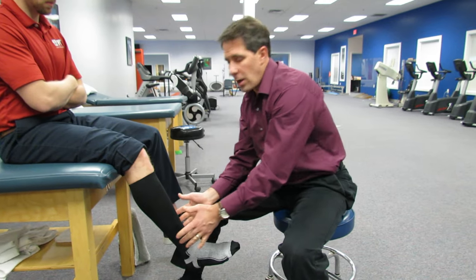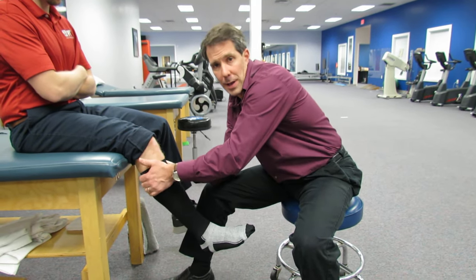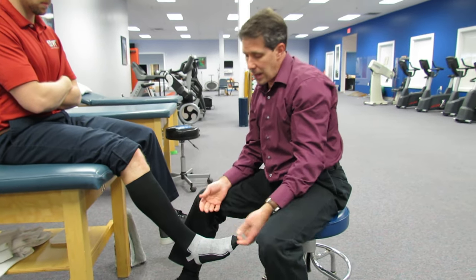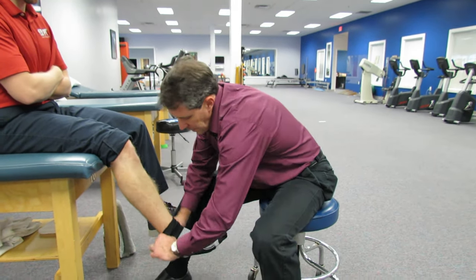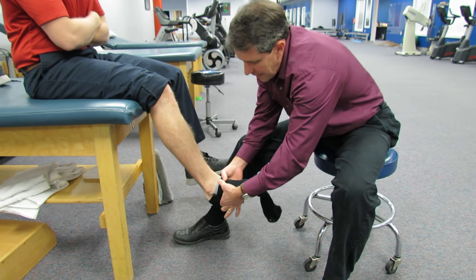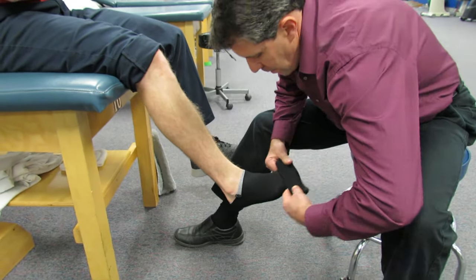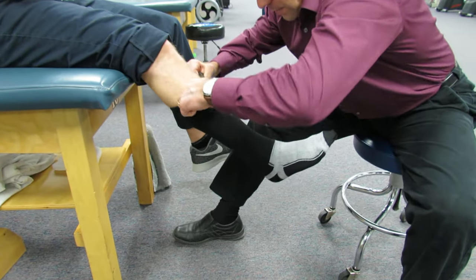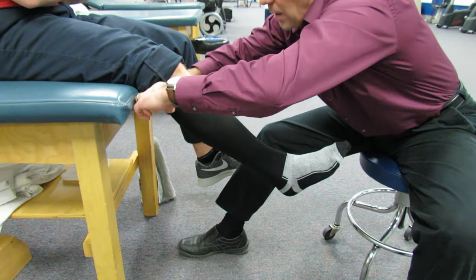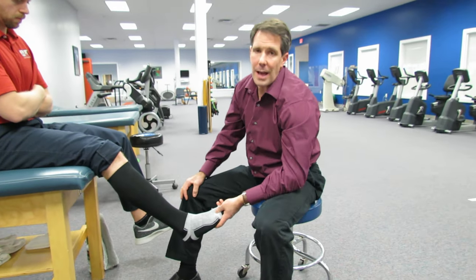Those work really well when putting on a compression sock because you can grip the material better and pull it up. Patients can do the same thing. The key is to unravel the sock so that when you push it on it gets up to about the ankle, and then you take the rest, pull it through, up and around, smooth it out, and lay it right up there. So that's how you put on the easy glider compression sock.